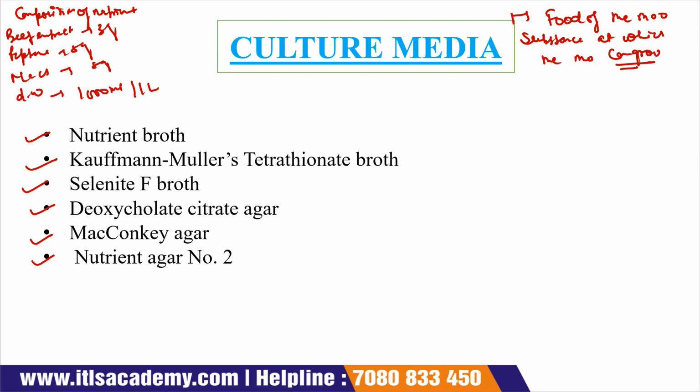Now the next composition is for the Kauffmann Muller tetrathionate broth.